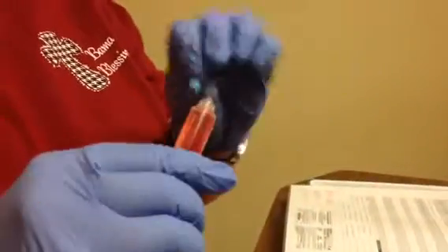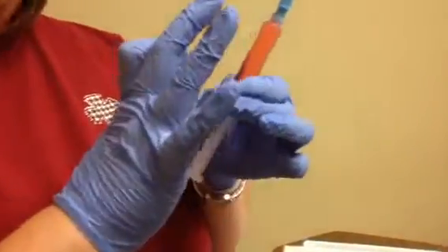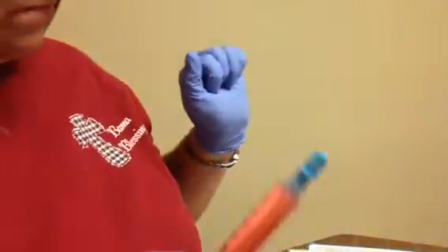Now I've diluted it with saline, and I'm just going to push my air out of it, okay? And I'm going to take my cap, make sure I keep this end sterile and this end sterile, and recap that. I'm going to label this with the name of the med, the dose, and the patient's name so that I know when we go in what we've got.